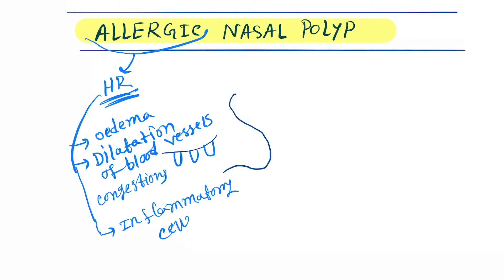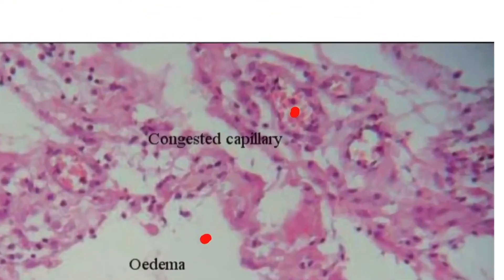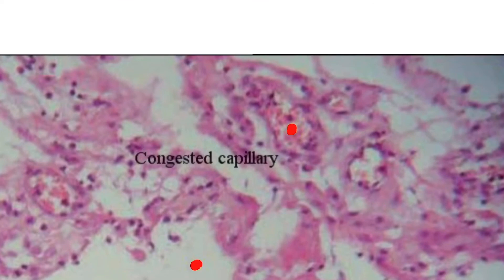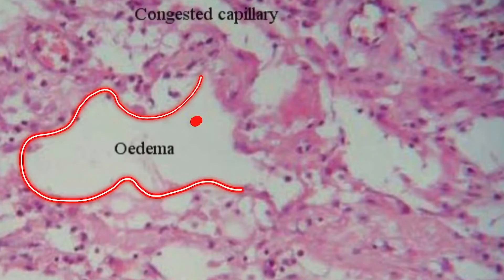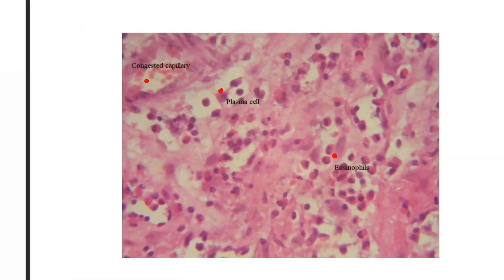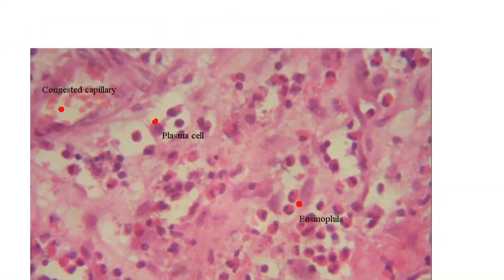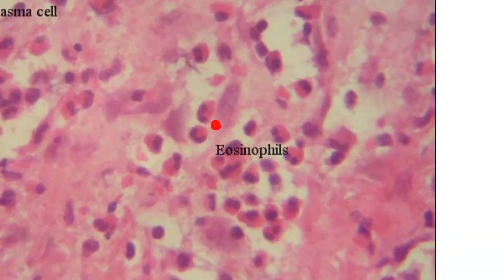Let's see the histological pictures. In the first picture, you can see the congested capillaries and edema, that is deposition of extracellular fluid. In the second histological picture, you can see plasma cells forming antibodies due to the hypersensitivity reaction, and here are the eosinophils — the inflammatory cells.